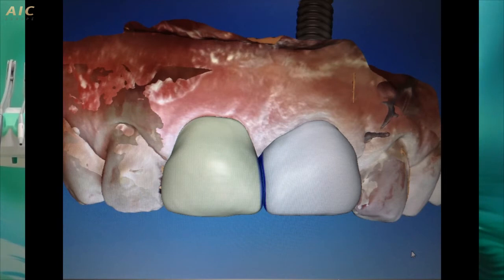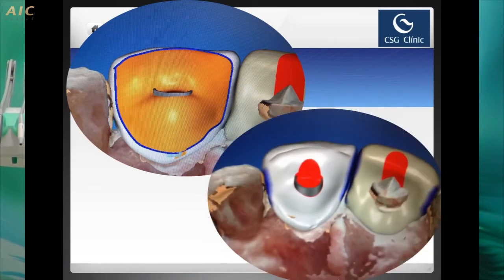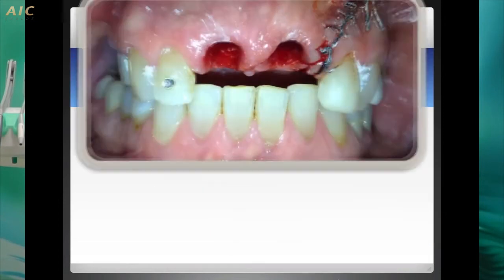And that's, for example, the most important part for me. Imagine this, you have 2 crowns, one provisional and one in permanent material, okay? You design the 2 crowns, and then you are going to reduce this one in occlusion. And what's happening at the bottom part of the 2 crowns is just the same. So this one is in subocclusion, the provisional. When the patient comes in the next appointment, we take this one and replace it with the permanent crown. That's how easy that technique is.